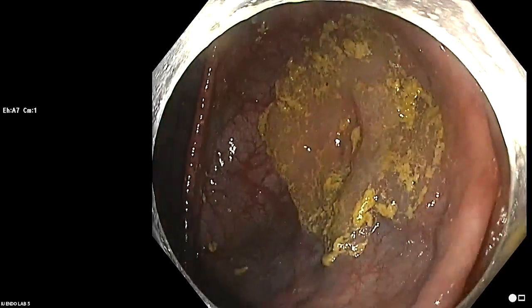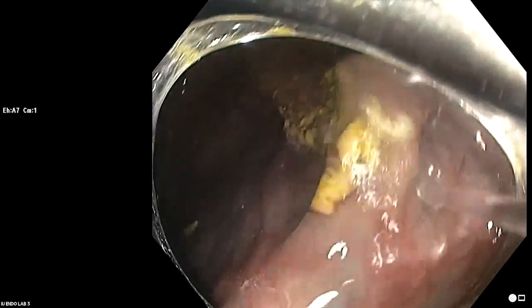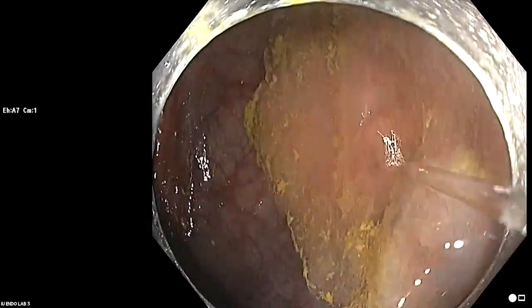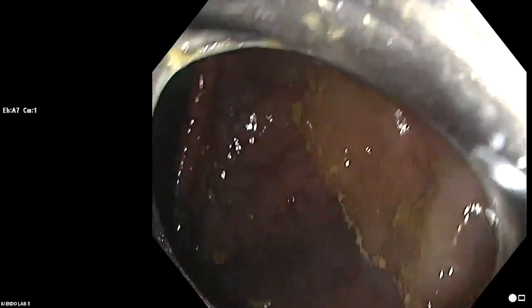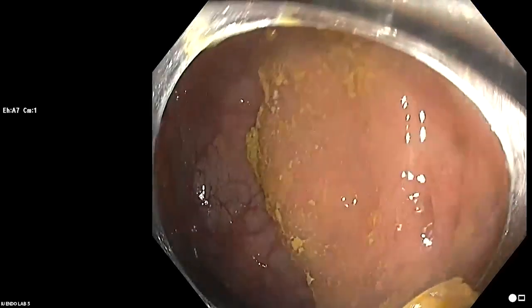Some people feel that if there's an obvious dysplastic portion in the lesion, you should use electrocautery. I personally don't think there's any data for that. If I see a dysplastic focus in an SSL, I still just take it out with cold resection. I think maybe the biggest thing we don't know yet is if we even need to inject these lesions, because we have seen data of people removing them piecemeal with very low recurrence rates. So let's go. I am going to inject this, and I think it may be of a little bit of value if we run into some fibrosis in the middle there where those divots are.